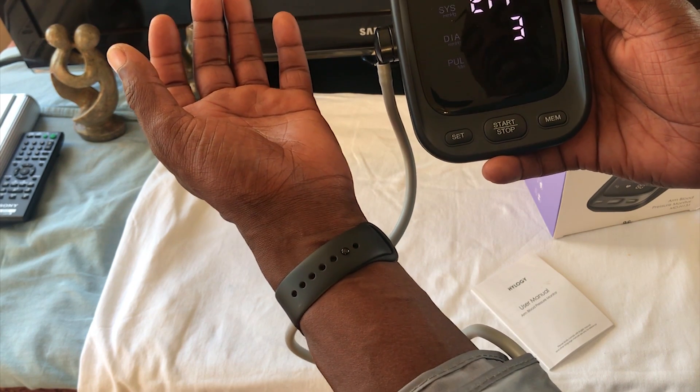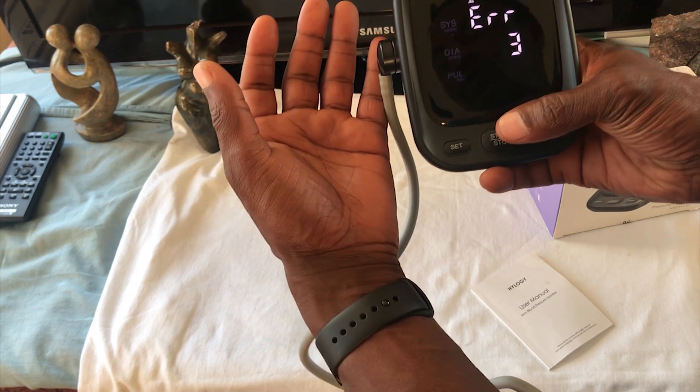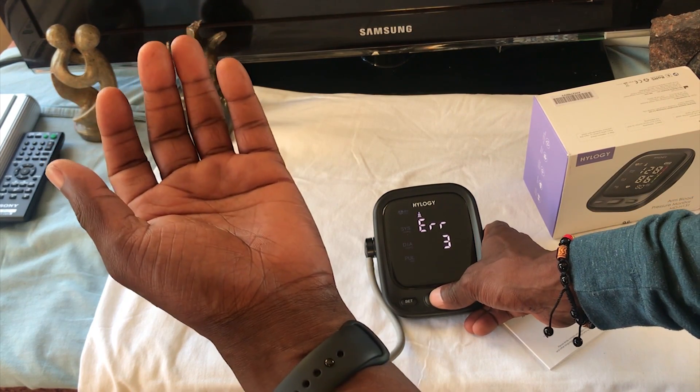It's an error again because I'm talking as I'm doing it, so it interferes with the reading. For this final reading I'm going to put this down, still hold my arm up, but I'll be quiet.